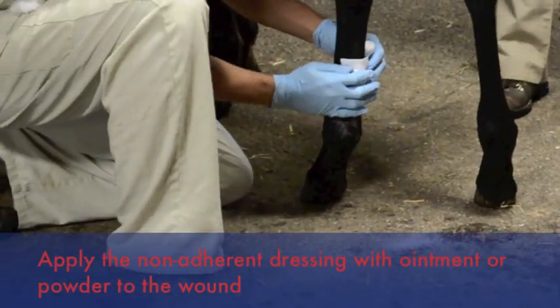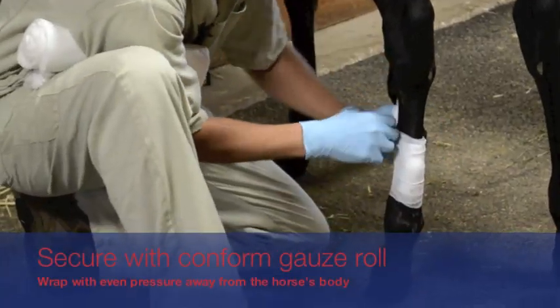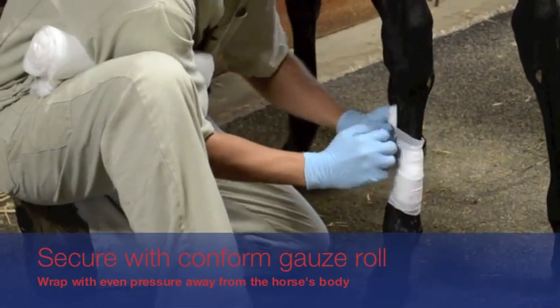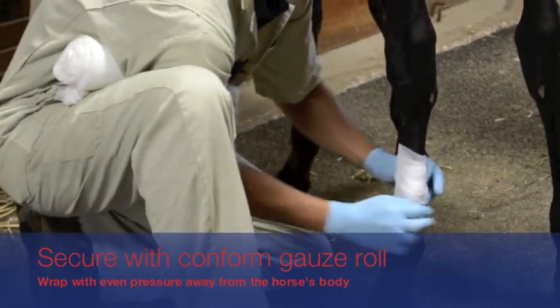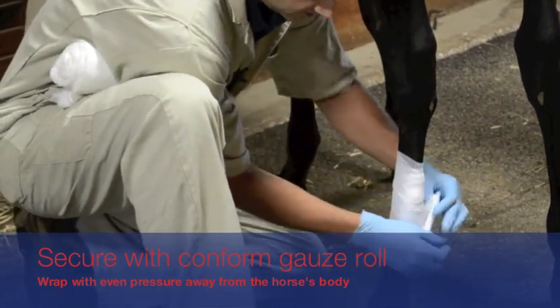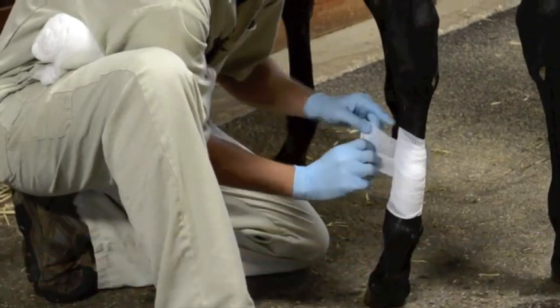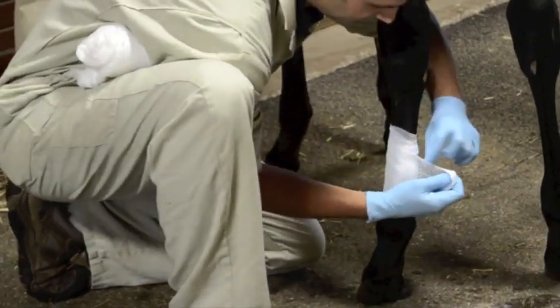The non-adhering dressing is applied to the wound, wrapping away from the body on the outside of the limb. This will hold the bandage in place but stretch and be able to move as the foal's leg moves. Make sure not to cause any irritation from the band.